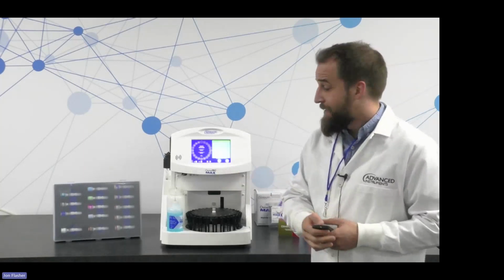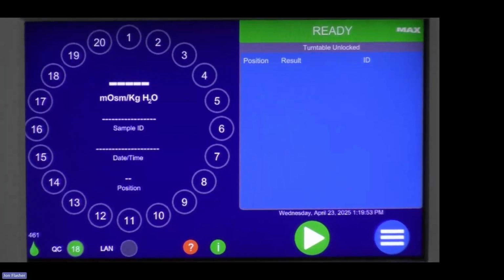In addition to that, I just wanted to come in here and show you a couple of other really cool features. So I mentioned every 500 tests, you have to change out that Max 500 kit. So if you look at the bottom left-hand side of the screen there, you'll see the little green teardrop with the number 461 next to it. That's because that's counting down from 500 from the last time that I actually changed out the Max 500 kit. And we'll count down. It'll turn yellow once we get a little bit closer. And then once we get down below 25 tests, it'll actually turn red, indicating that we should probably change that Max 500 kit out soon. Once you reach the end of that limit, it actually won't let you test anymore until you perform the maintenance.